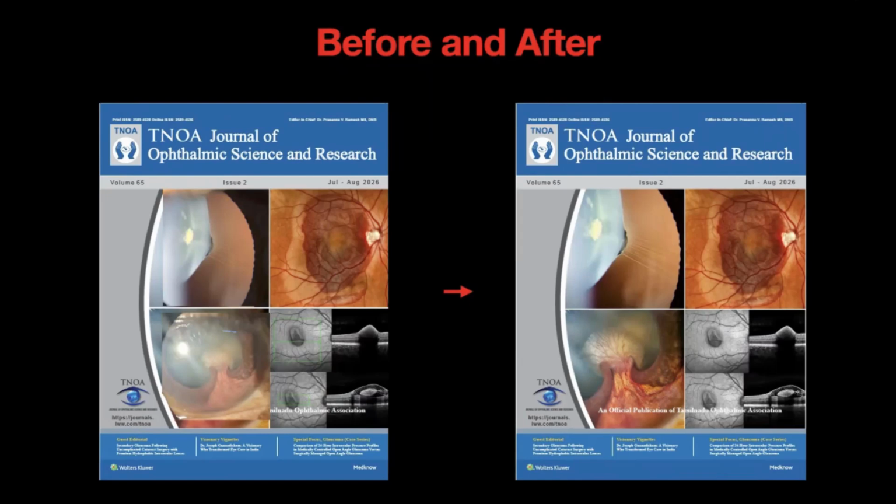It's a neovascular glaucoma with a peripheral anterior synechiae extending up to the lens, and you can see how imaging can actually be enhanced. There is some pixelation because I'm sharing it over Zoom, but I still feel you can appreciate it to some extent.